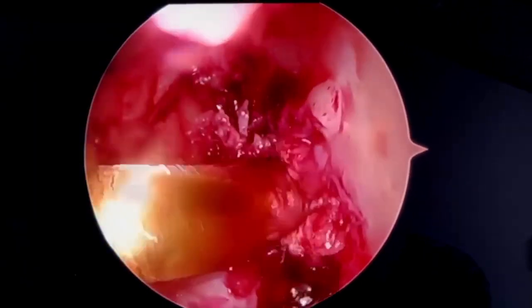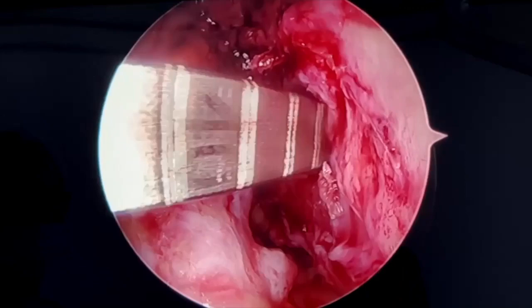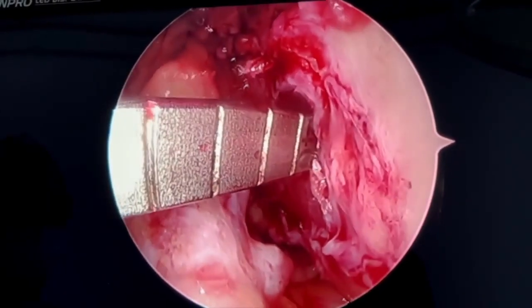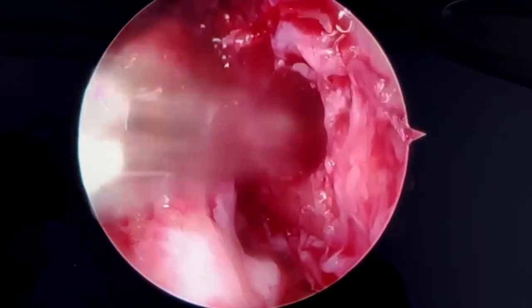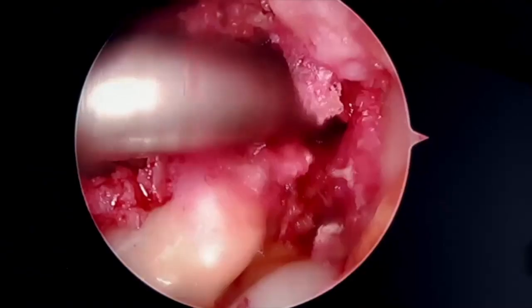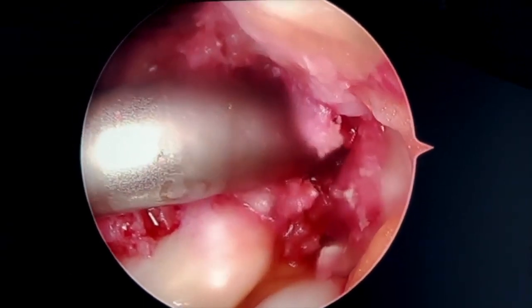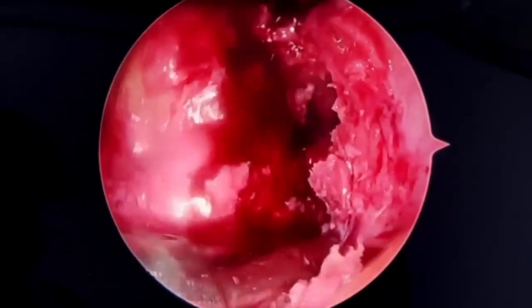A 4.5 mm drill bit is used to drill through the femur. A measuring guide and passing pin are used to ensure accuracy. Next, using the inside-out technique, the femoral bone is drilled to the appropriate size for the ACL. After drilling, the proximal portion of the femoral bone tunnel is cleaned with a shaver to reduce the risk of soft tissue entrapment.